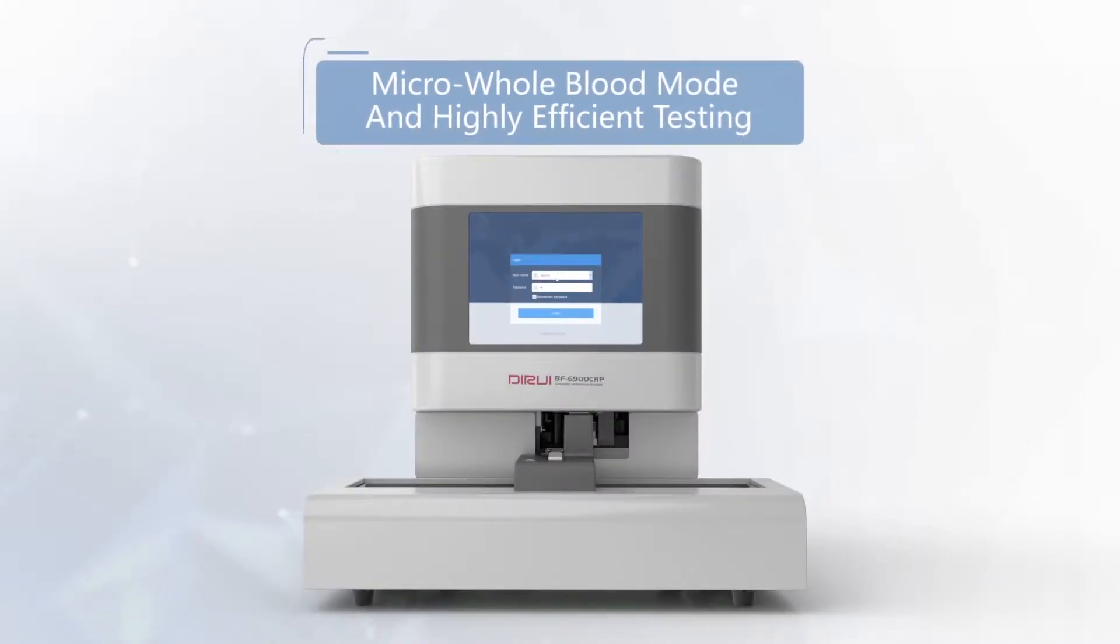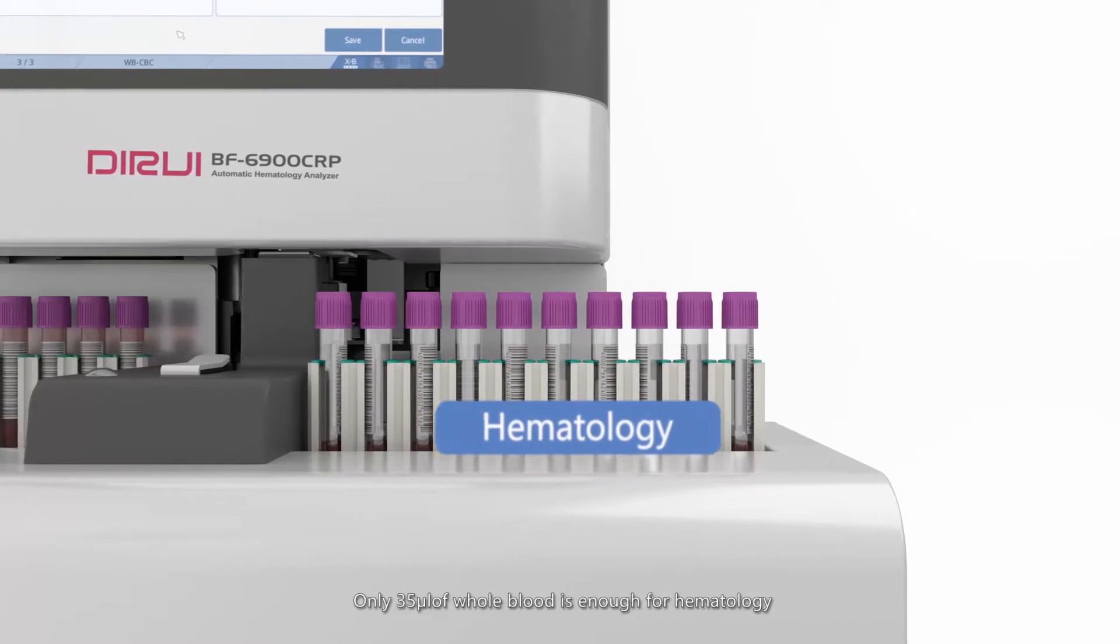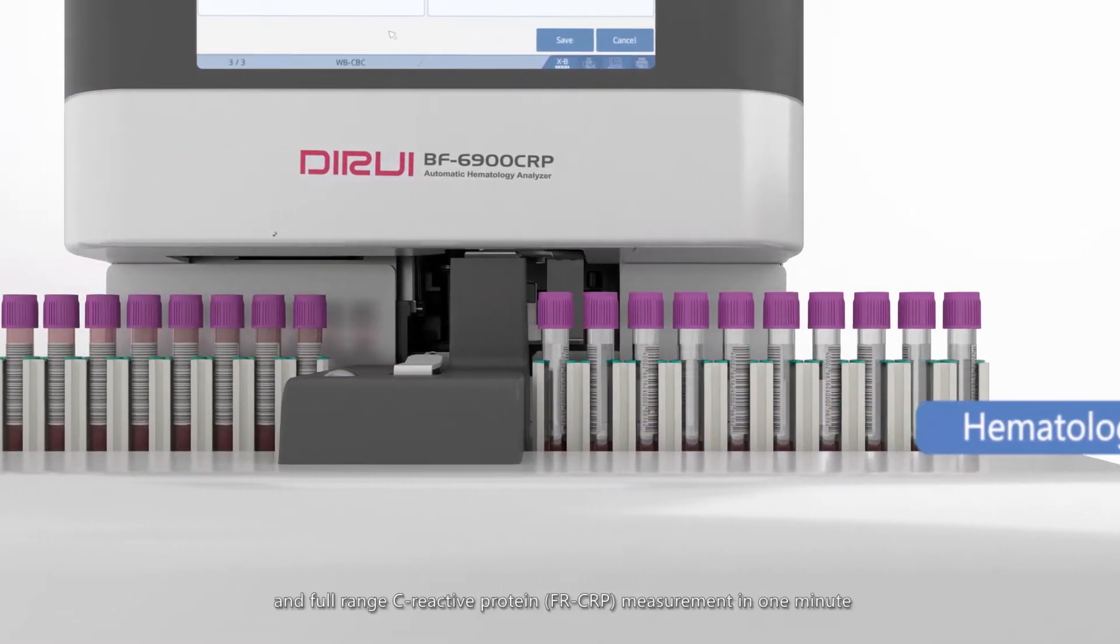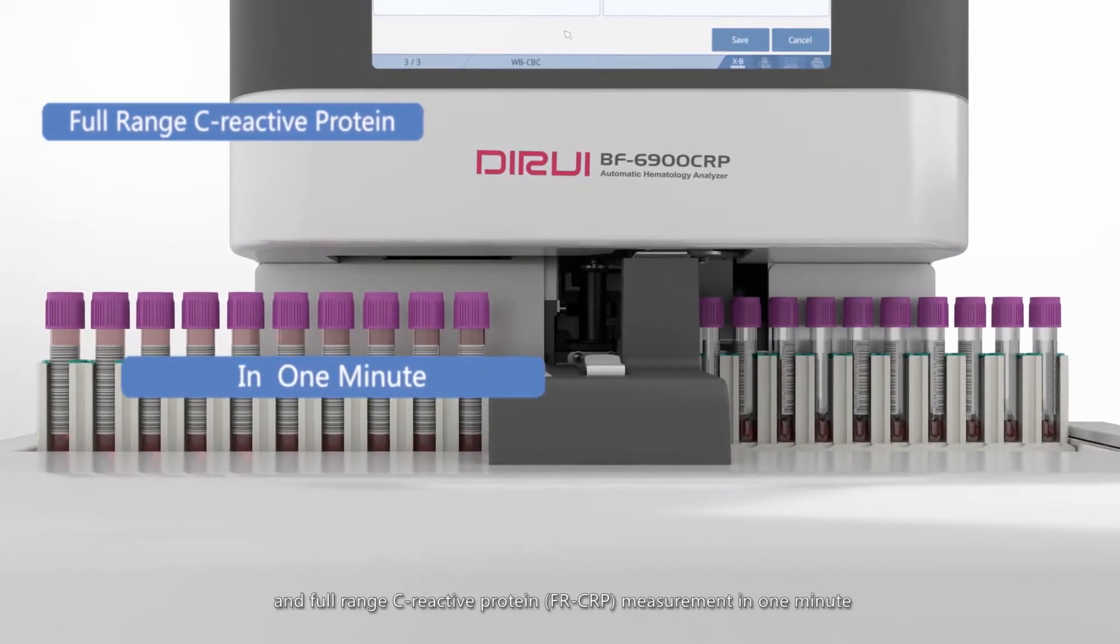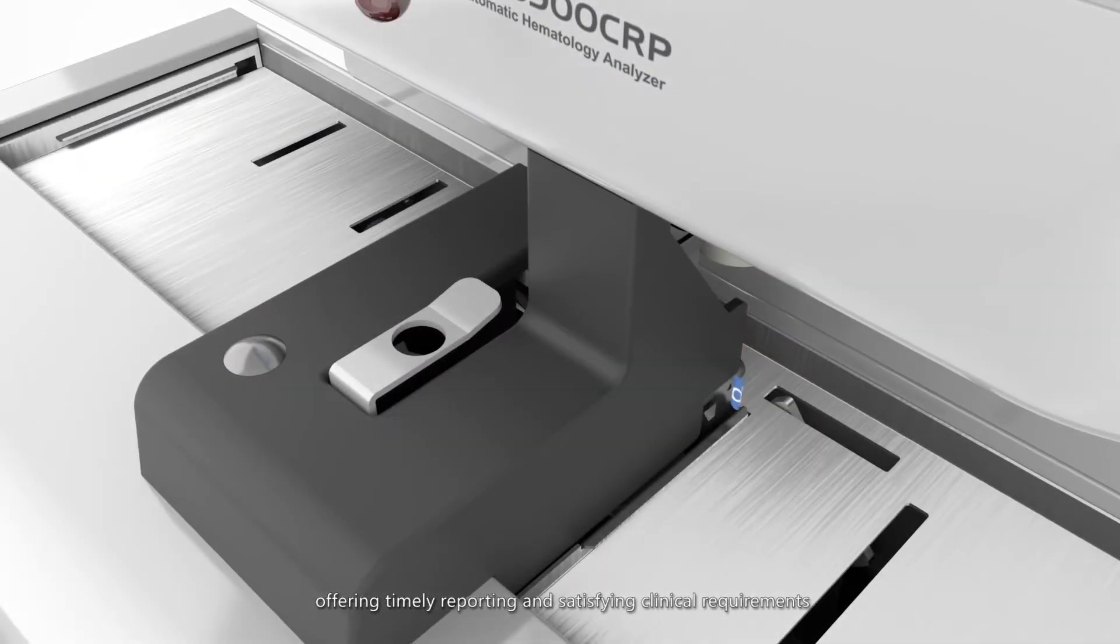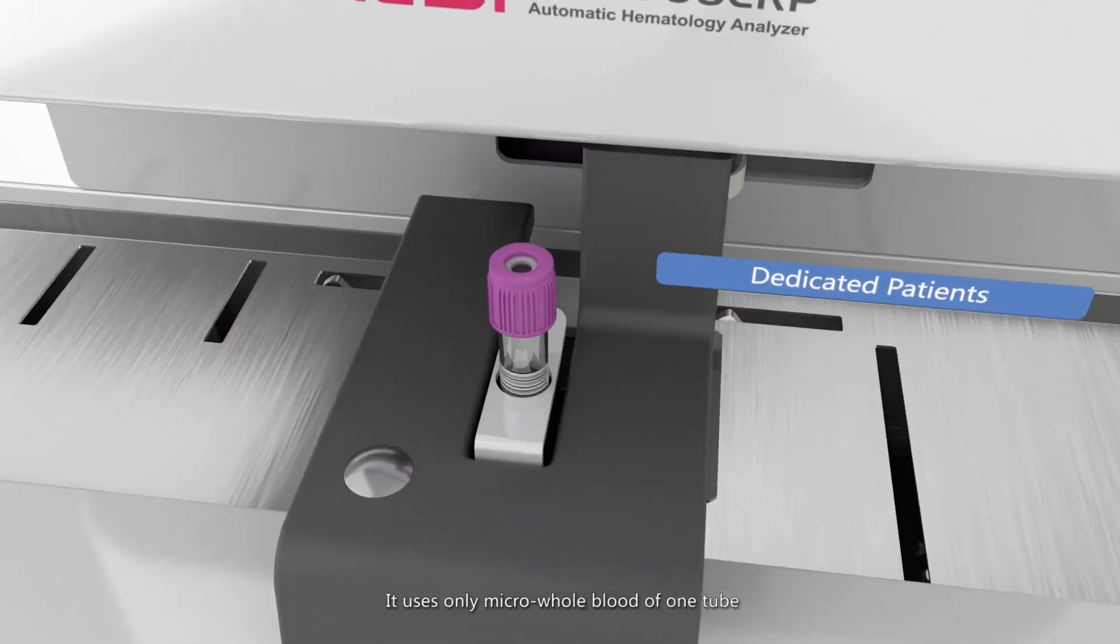Micro whole blood mode and highly efficient testing. Only 35 microliter of whole blood is enough for hematology and full-range C-reactive protein measurement in one minute, offering timely reporting and satisfying clinical requirements. It uses only micro whole blood of one tube.